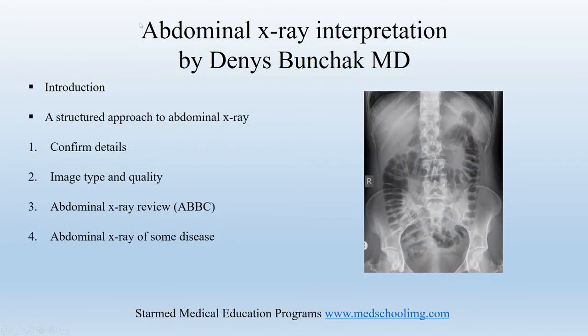So today I'd like to discuss with you abdominal X-ray and its interpretation. Before we start, I'll just want to tell a couple of words.